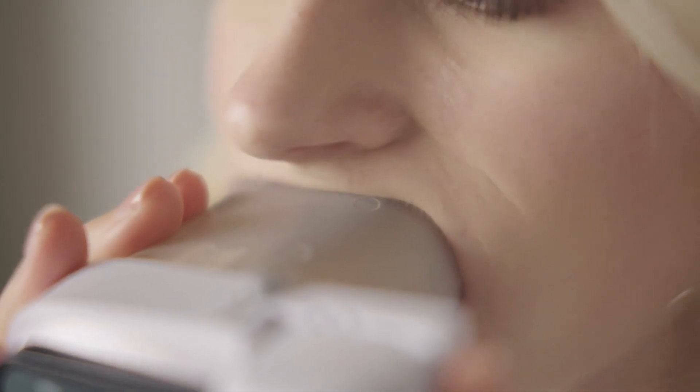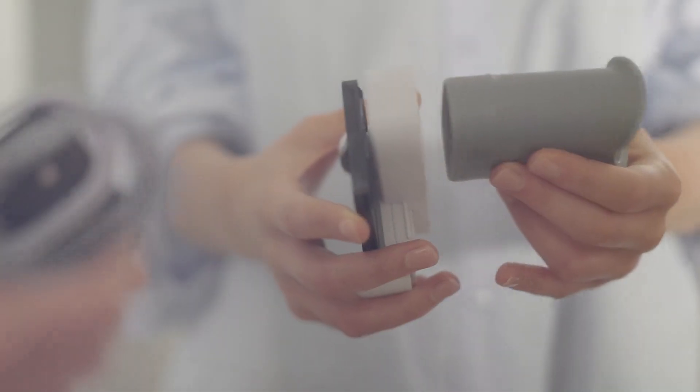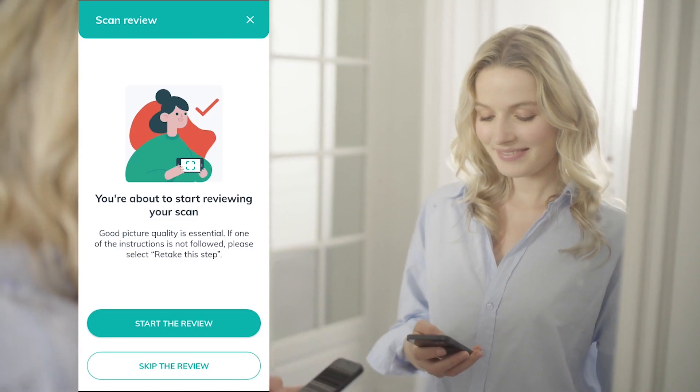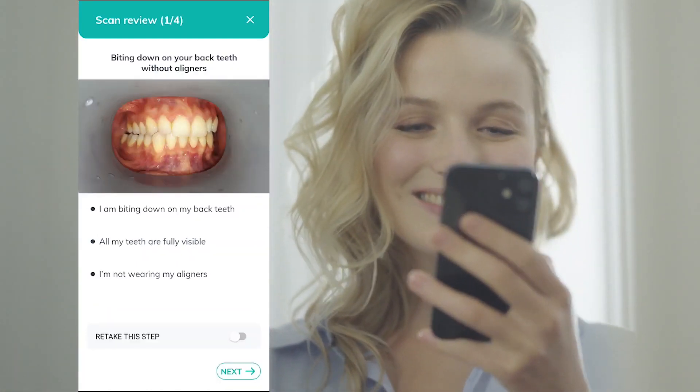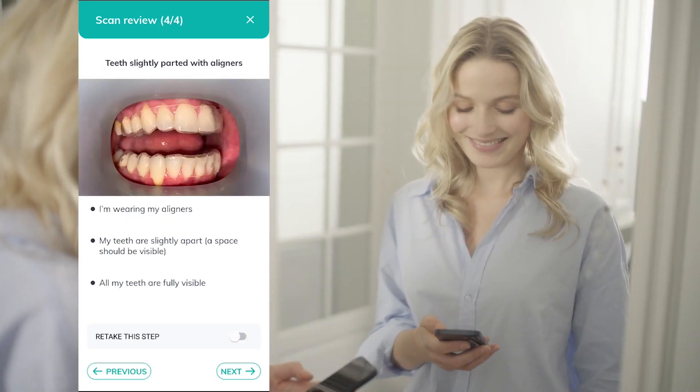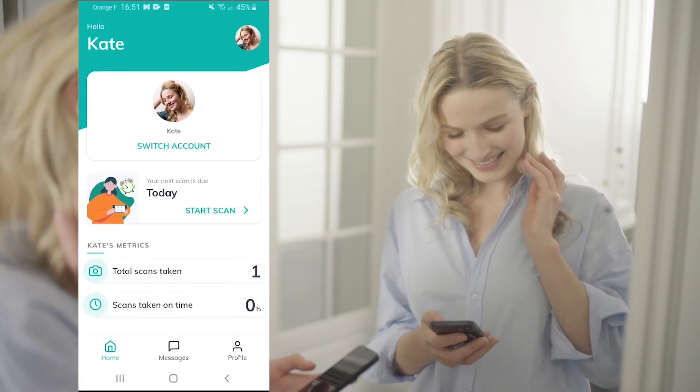Take the cheek retractor tube out of your mouth and remove it from the phone support by holding the phone support in place and pulling the cheek retractor tube forward. Take the time to review your pictures. If your pictures do not follow the on-screen instructions, you can simply retake them. Once all your pictures have been validated, you can send your scan.